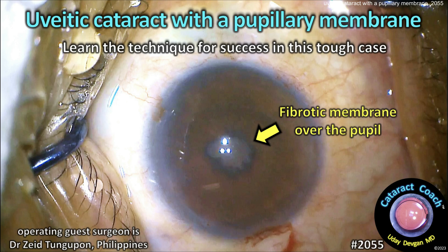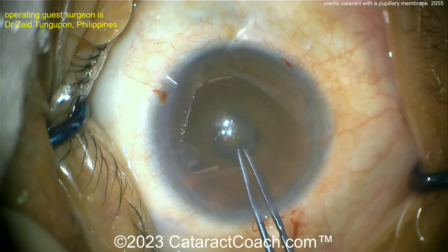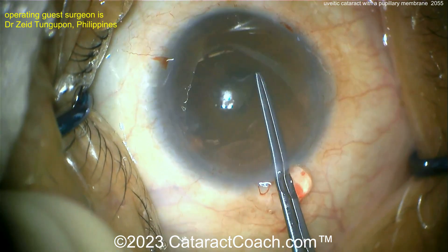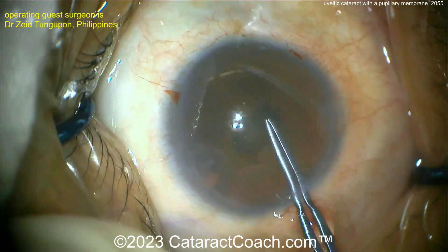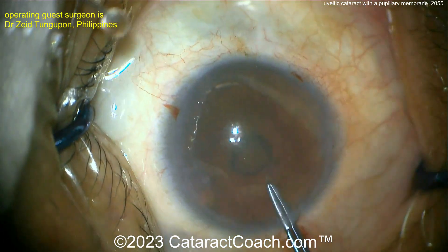CataractCoach.com — uveitic cataract with a pupillary membrane. Learn some techniques for success in this tough case. Here's the patient; you can see there's a membrane in the pupil. This is using the capsulorrhexis forceps, or other small forceps, to try to peel off that membrane.